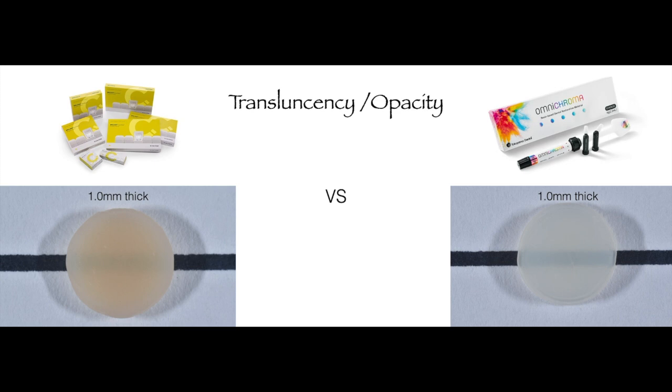It is very noticeable the more dentin-like opacity with very little translucency of Brilliant EverGlow A2B2 when compared with, I would say, very translucent Omnichroma. Please keep this photo in mind when you need to restore a large class 4 or a through and through class 3.